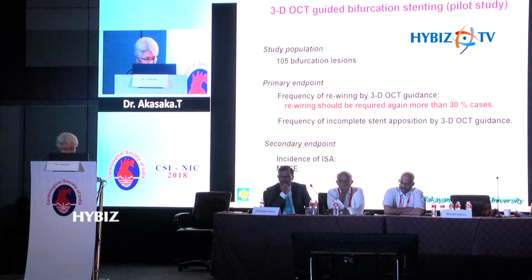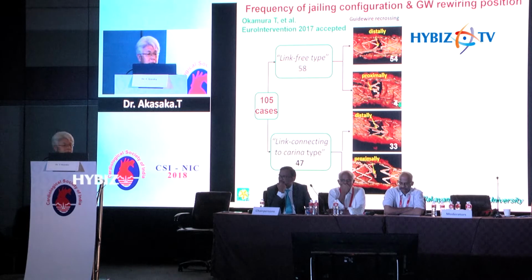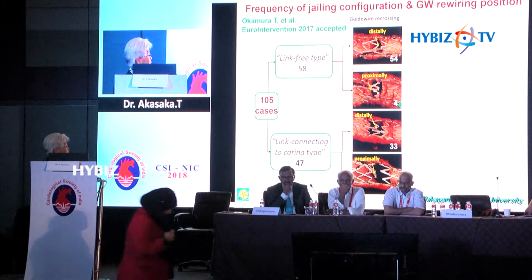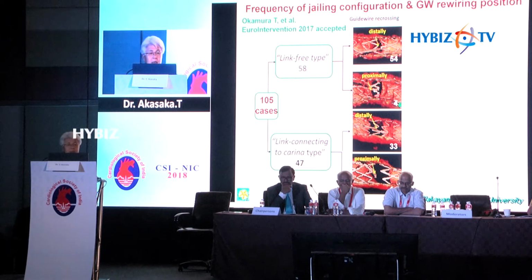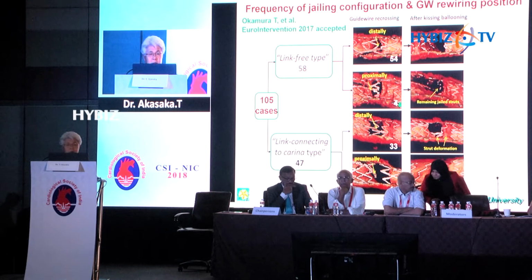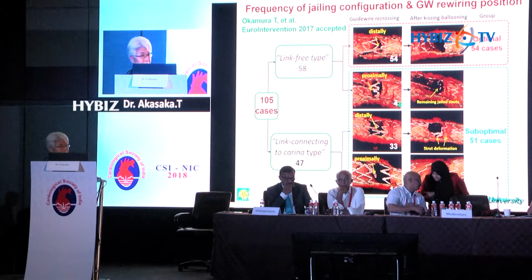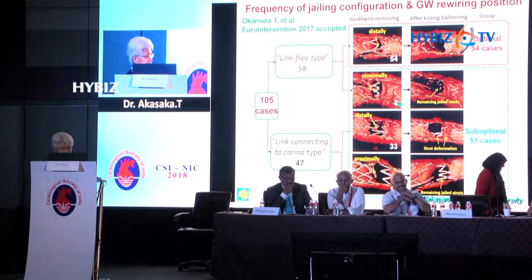And we tried to compare the result in cases with optimal and suboptimal results. You cannot select the position of the link, so it's by chance. So link-free type and link connecting type are nearly half and half. And even in the link-free type, you succeed to get an optimal result in only 54 cases in this registry, and suboptimal result is 51.